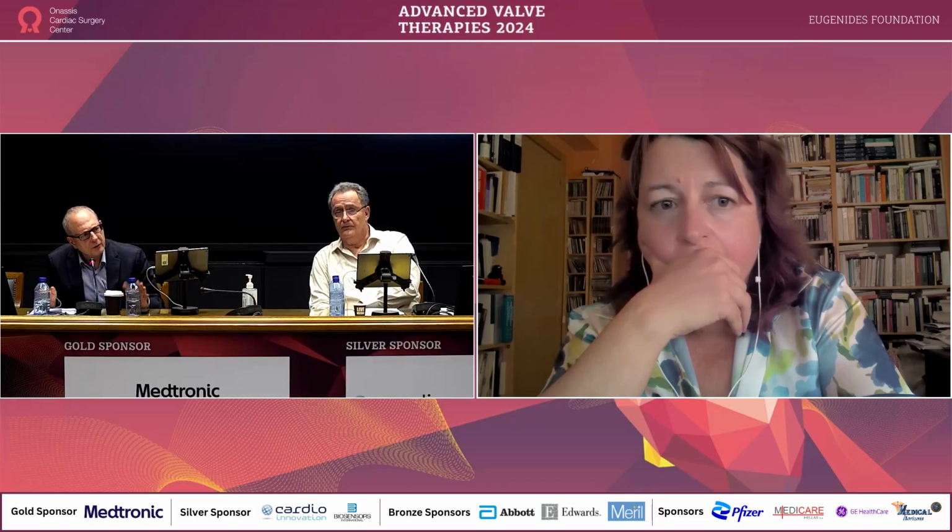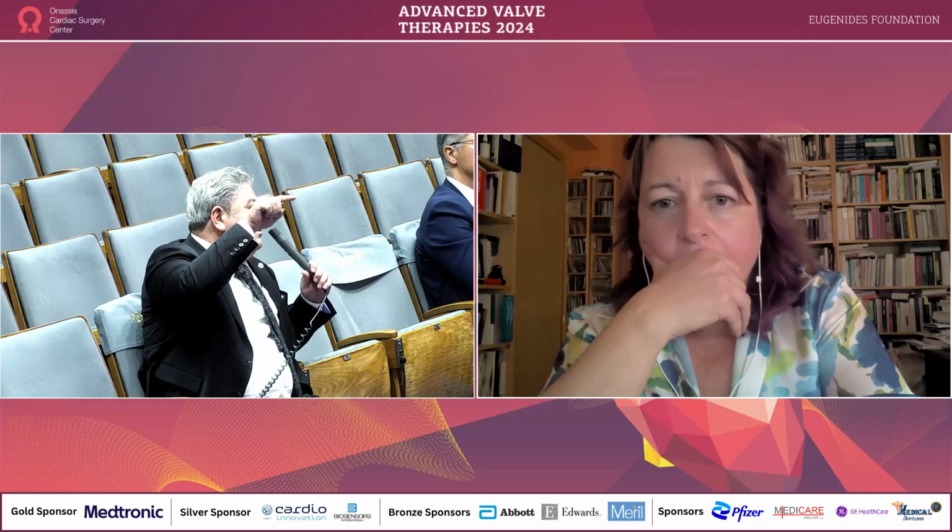The echo shows it clearly. I don't know, Theo, what is your experience? You get the appropriate orientation? Because I fully agree that for the mitral paravalvular leaks, real-time 3D transesophageal echo is very, very important compared to CT. For the mitral leaks, we never use CT, but for the aortic leaks, transesophageal echocardiography also gives nothing, really. If there is a large leak, TEE shows suspicion about paravalvular leak.